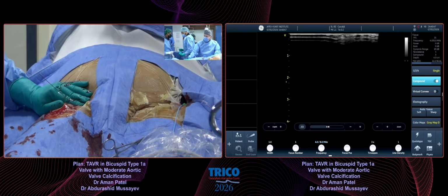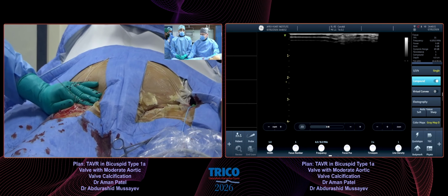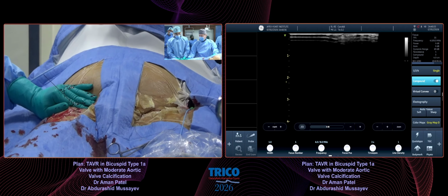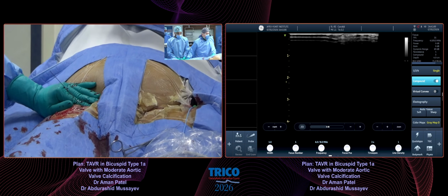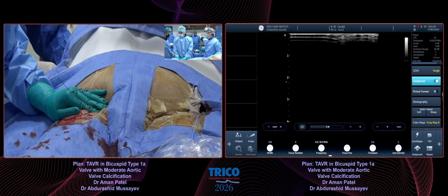More Xylocaine. And now it is important also to do very good local anesthesia. It will be much more comfortable for the patient. And now full heparin was done. And usually after the puncture, we could start to crimp the valve.